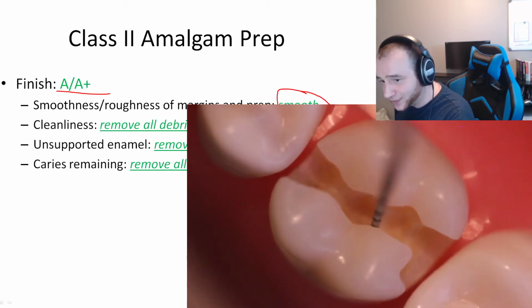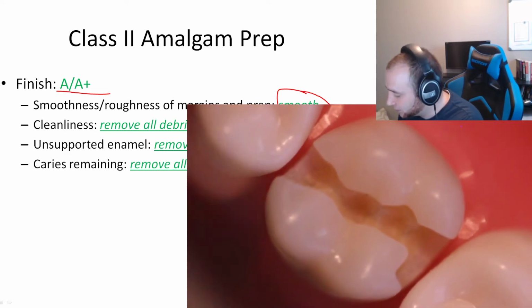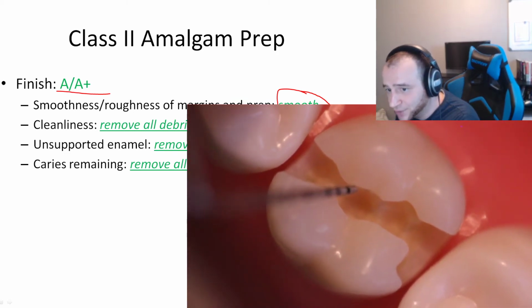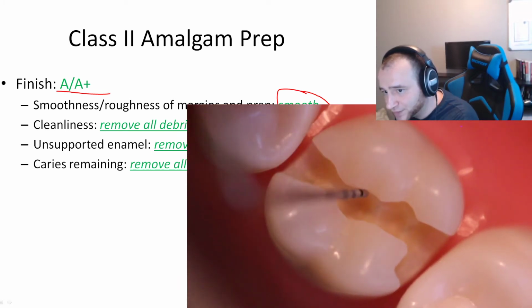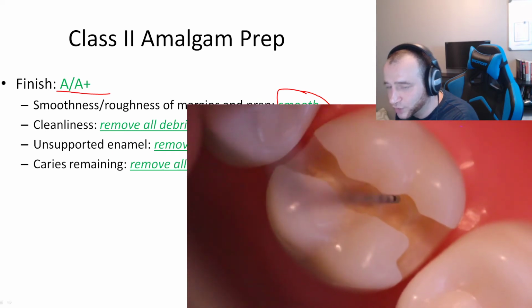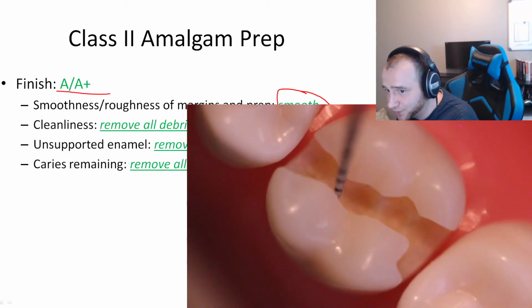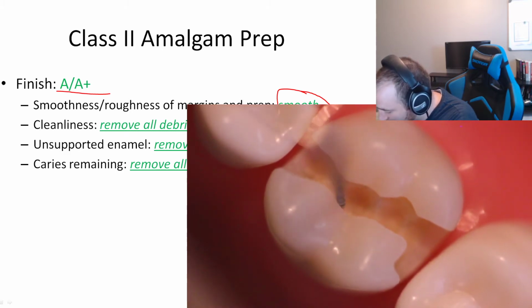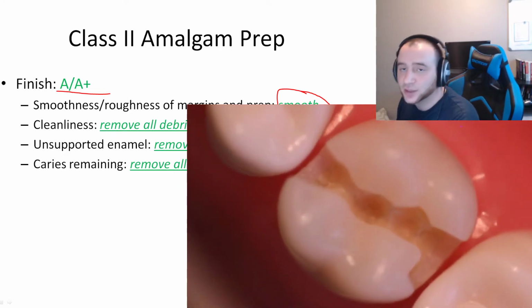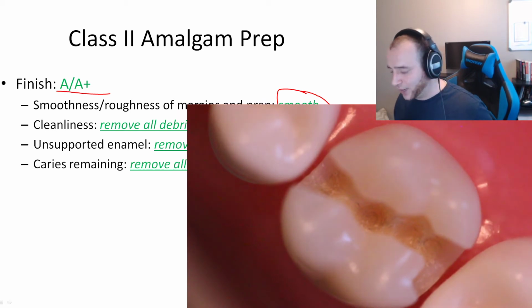Another one is, if you find where the roughness is, be accurate. Some mistakes occur this way. Let's say you found a roughness here. What the student does is they start going over the whole wall. If the roughness is only there, why are you going all over the wall? You might remove the entire wall again and still have that roughness. So if you have a roughness, let's say here, attack that area only. Rehearse your movement first, and then go halfway with the pedal. Go once, check it again, go twice, see if it's gone. Work slowly and you'll get smoothness. And again, the half push on the pedal helps as well.